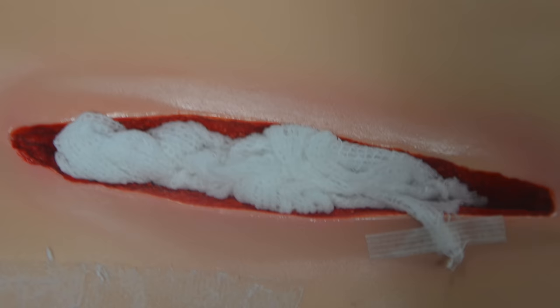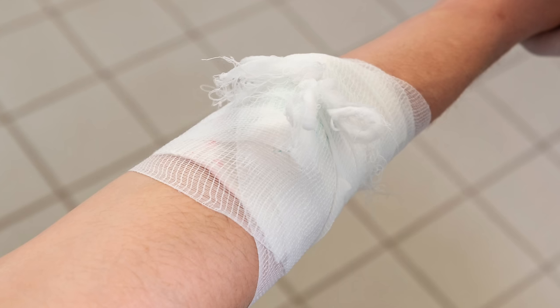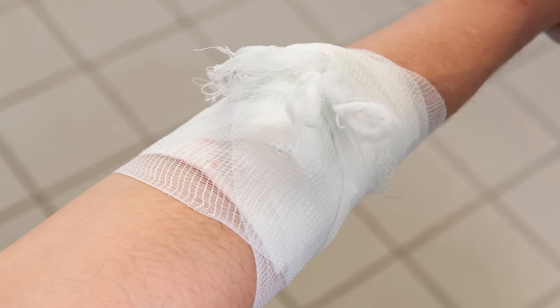Now if the wound is at a junctional site such as the groin, armpit, or neck where a tourniquet can't be applied, then the wound needs to be packed with gauze, applying pressure to the bleed location and directly to any damaged artery or vein if it can be located, and then a pressure bandage needs to be applied to keep pressure on the wound. This is also the procedure with a limb wound that's not severe enough to require a tourniquet but is still bleeding heavily — again, pack the wound and apply a pressure bandage.